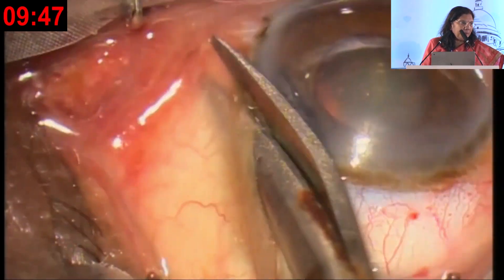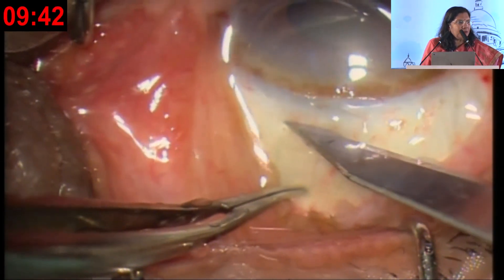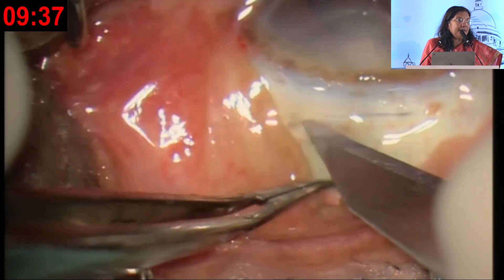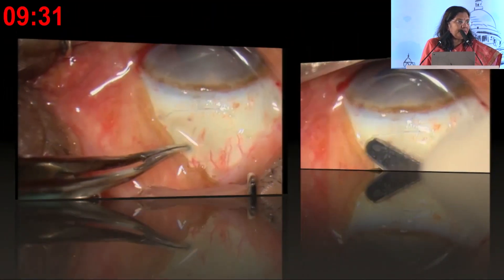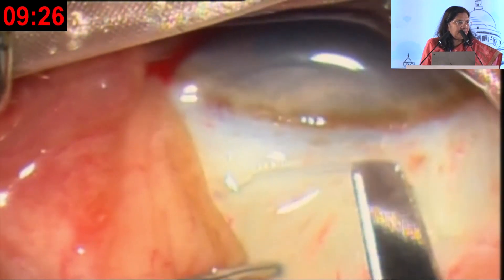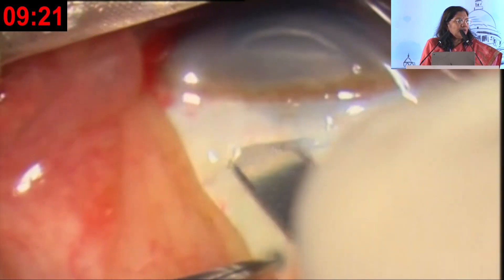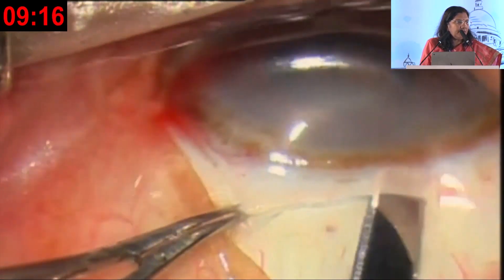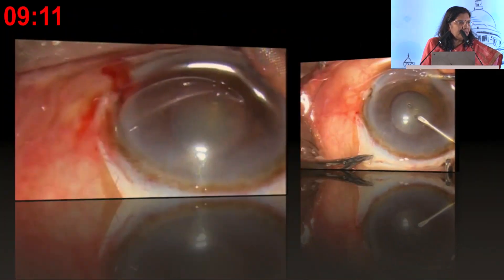This is a very small pupil — an older individual with a sclerosed pupil. Many patients have these small pupils, and you may get scared to do phaco because of iris chafing. As usual, this is a modified funnel incision with a crescent, making the tunnel into the mid-sclera and then going into the cornea, which gives you a self-sealing corneal valve — very important. The pockets are made, and then entry inside the eye.